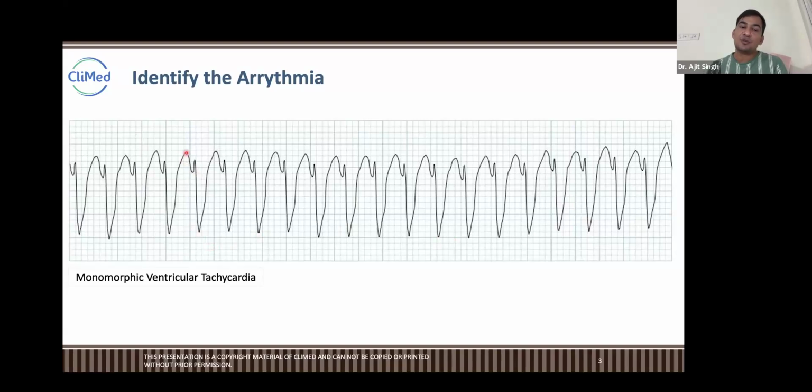First, the QRS complex is wide, a broad QRS complex. See from here. Look at this, this point, it starts. This is QRS, right? This complex is very broad. It is starting from Q, so the QRS complex is still here. The QRS complex is very broad.